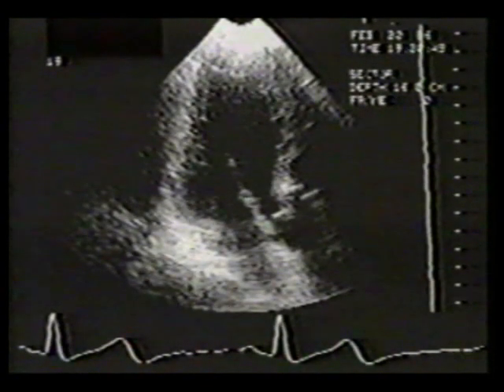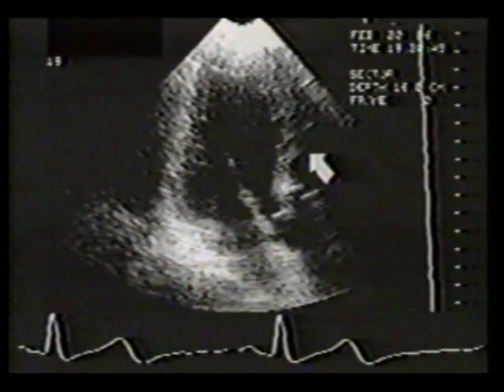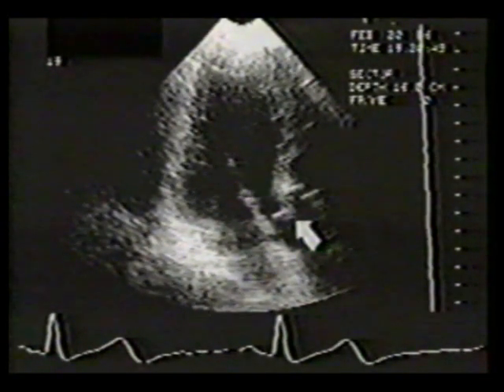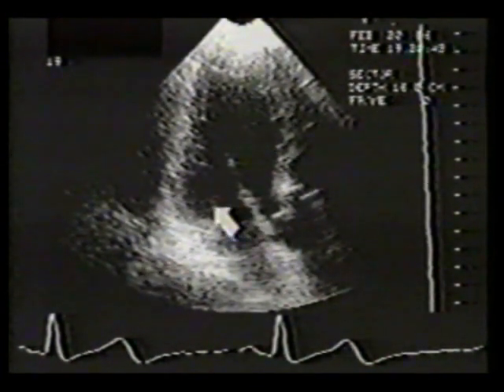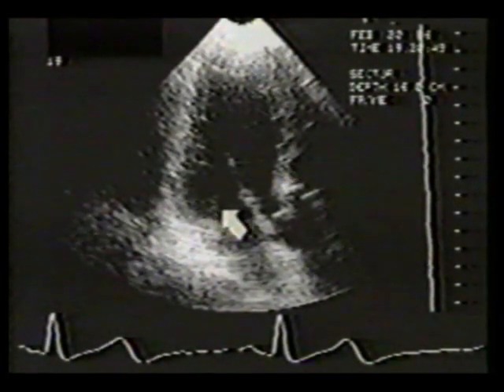The transducer is rotated clockwise from the four-chamber format to image the left ventricle along its long axis. In this diastolic frame, only a small portion of the right ventricle is seen. Note the aortic root and the aortic valve. The aorta is continuous here with the base of the anterior mitral leaflet. This is the posterior mitral leaflet, which is considerably shorter than the anterior leaflet.